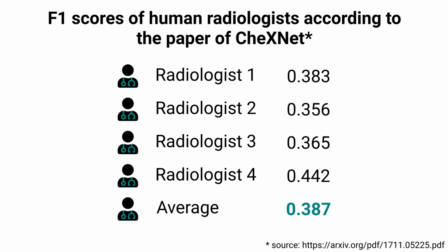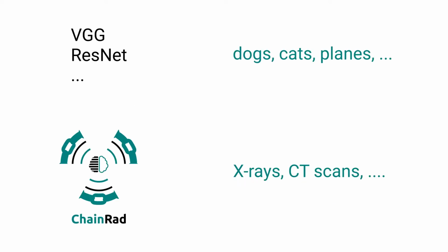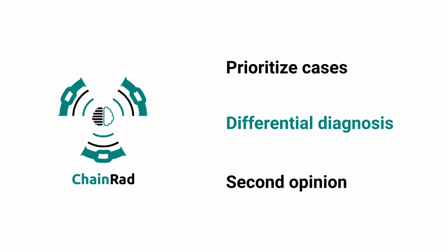Why? Since our long-term goal is to make pre-trained networks for healthcare that is learned from radiology images. This can be a huge impact in the long term. In the short term, the software can help to prioritize cases or in differential diagnosis. Furthermore, it is useful when there is no possible way to get a second opinion within a short time range.